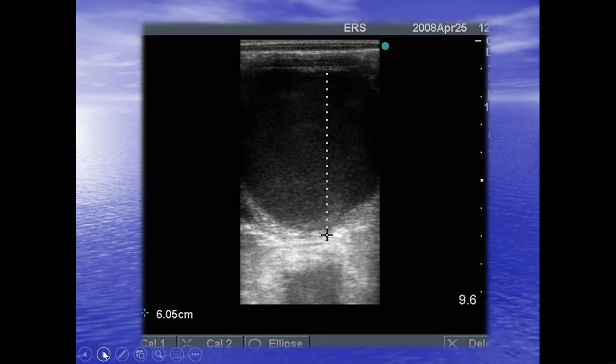Now, I said I'd come back to this. These echogenic particles in the ventral margin of the follicle. Yes, they are a sign the mare is close to ovulation, but they're also a sign of something else. If they become more widespread, therein lies a bit of the problem. What does more widespread mean? If they become more widespread within the follicle, then they can be indicative of the mare going on to form an anovulatory hemorrhagic follicle, i.e. a type of follicle failure, which we'll talk about in a later webinar.